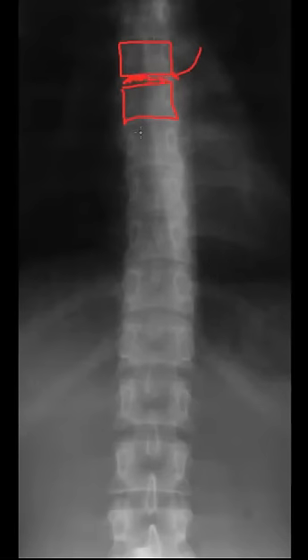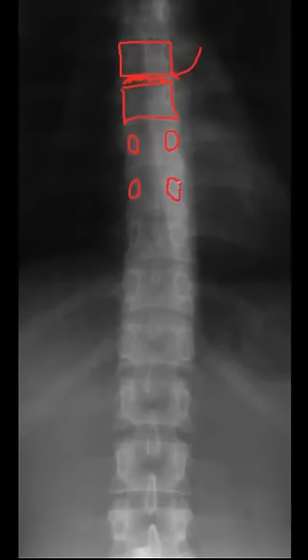Now let's get to some of the smaller anatomy — pedicles, which are also known as the eyes of the spine, seen very well in the thoracic region. In the thoracic region, the pedicles extend pretty much in a posterior direction from the vertebral body, which is different from the cervical spine where the pedicles extended posterolateral. So on the AP projection of the thoracic spine you can see the pedicles very, very well.